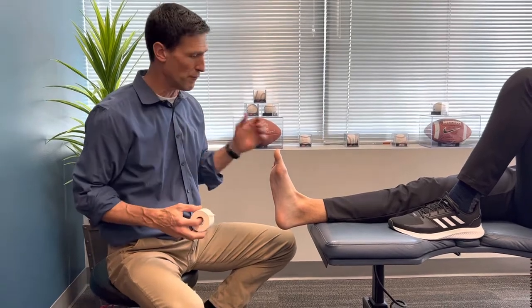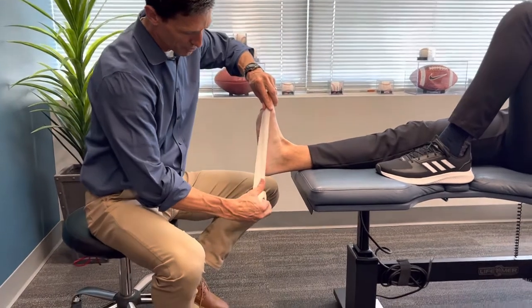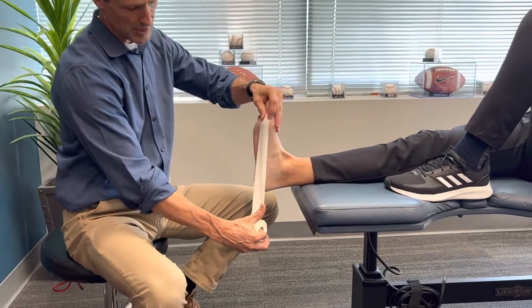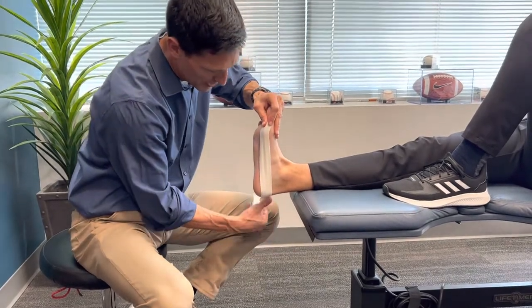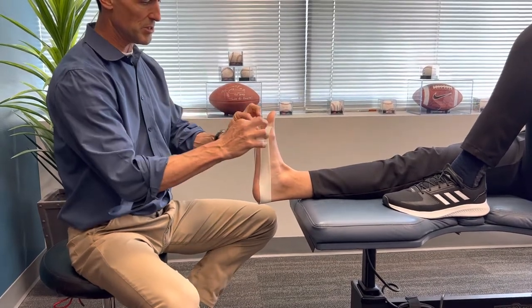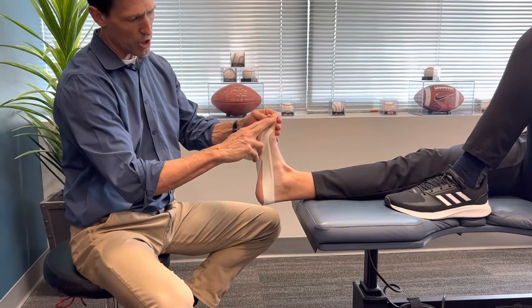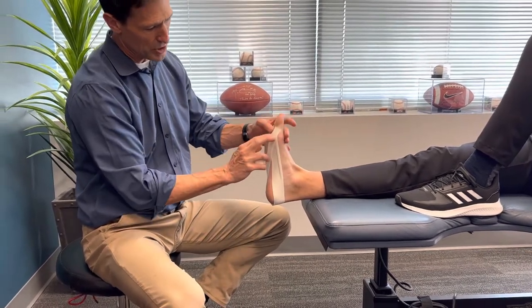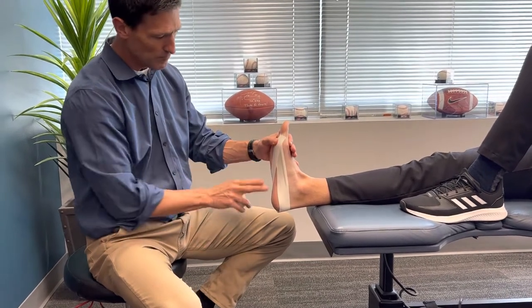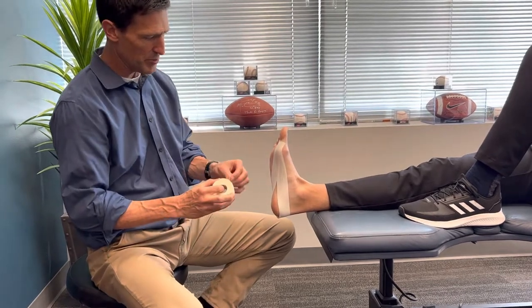The best technique I've seen for plantar fascia taping — whether you have plantar fasciitis or fasciosis — is to anchor on the big toe, right at the base, just like that. Then wrap around the heel, get it nice and sticky, come back around to the same spot. You can go up onto the toe a little bit or wrap around, but you just have to make sure you get past this joint right here. Stick those down — they don't always stick great, but you do the best you can.